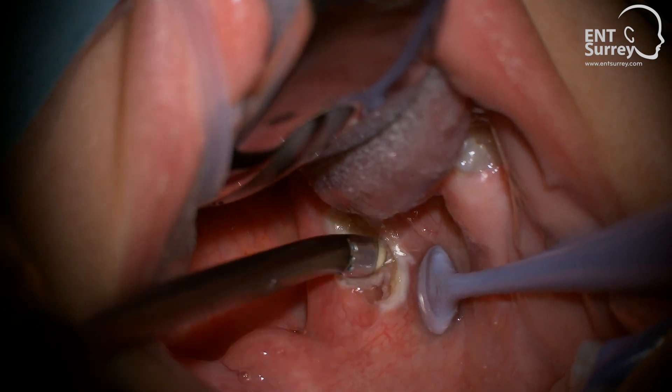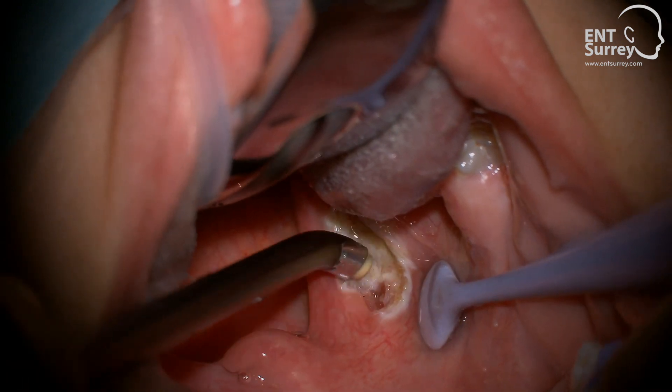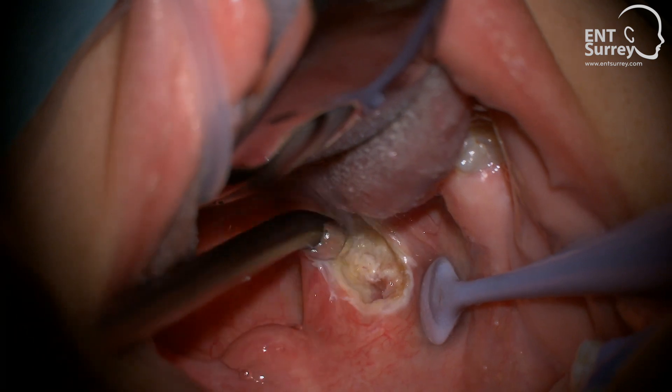When performing the intracapsular technique in adults, it is important to correctly set the saline flow through the wand to a light drip when the coagulation pedal is pushed. Too little saline flow can contribute to blockage.